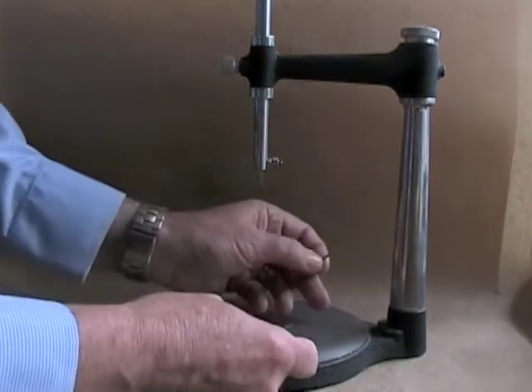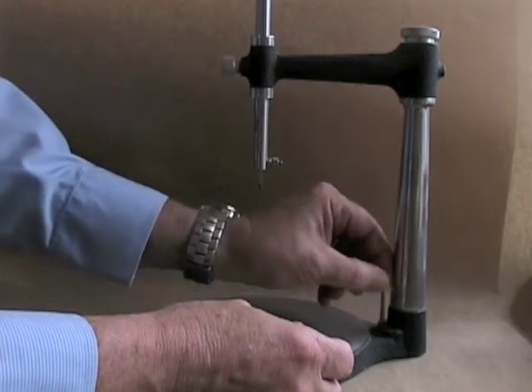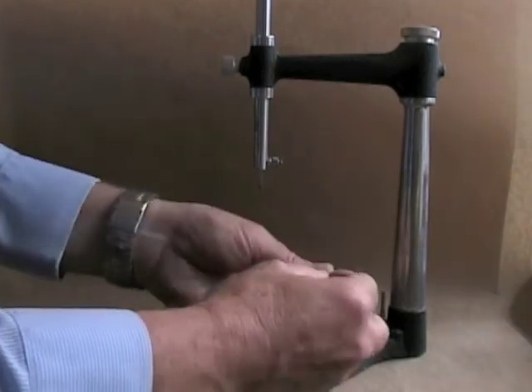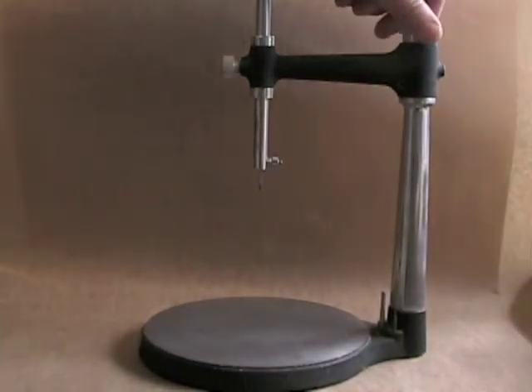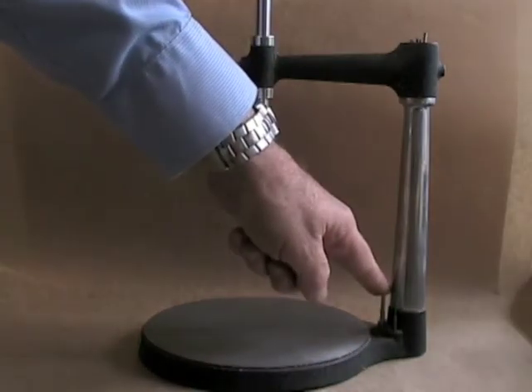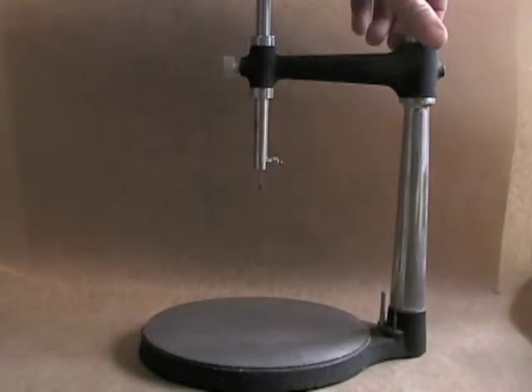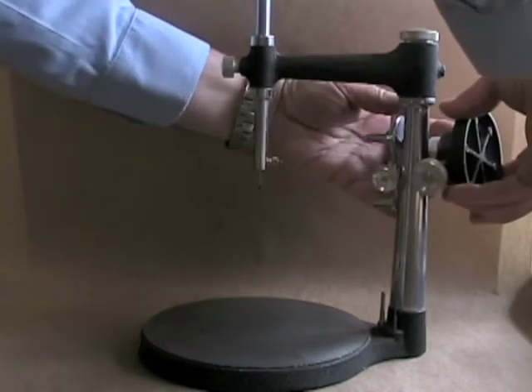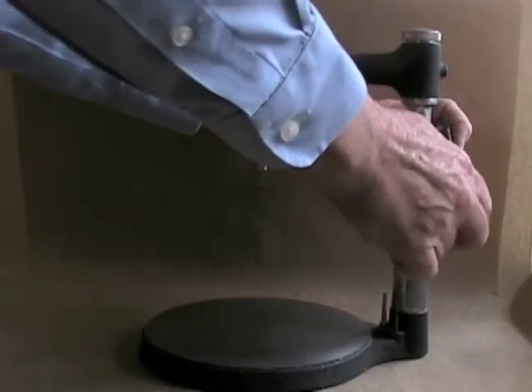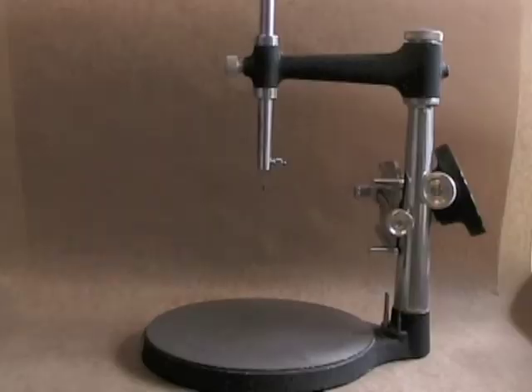When not in use, a good place for your surveying tools is on the base, so they're easily accessible. When transporting the surveyor, remove the tools so they don't fall out and get lost — you can store them in the top compartment and screw it on. You can also tighten the cast holder onto the shaft so it doesn't fall when moving.